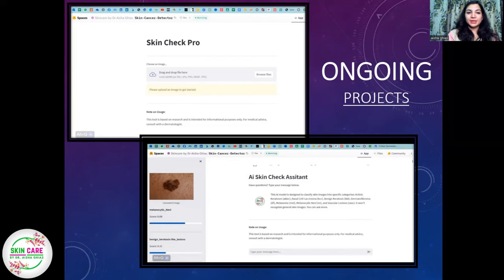Recently, in collaboration with some IT people, we have come up with a solution. Not everyone is good at dermoscopy or trichoscopy. But even if you are not good at it, you can at least capture an image, because capturing an image is very simple. You just put the scope on, put your phone on, and capture. It's as easy as it seems.